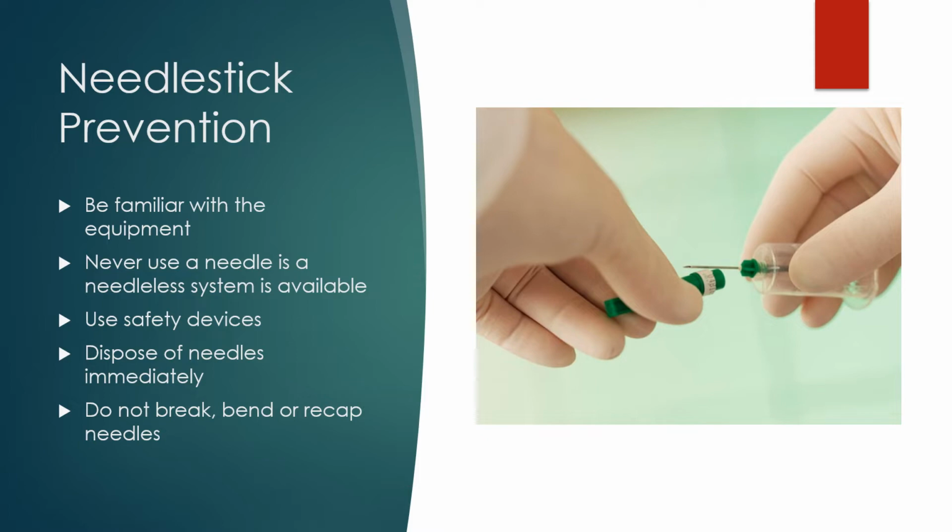You always want to make sure you never recap a dirty needle. If the needle has been used, I will never recap it. So make sure you say that to yourself over and over again. If I've used the needle, I will never recap it. If you need to recap a clean needle, it's a one-hand scoop to prevent any undue needle sticks, and we will also practice this in lab. But remember, you never recap a dirty needle.